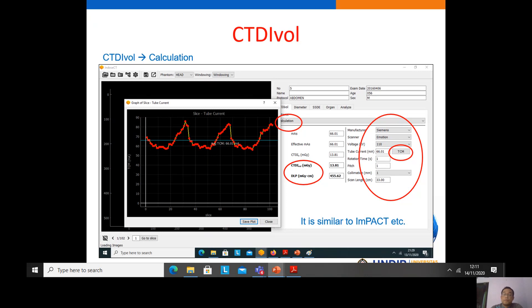If the images are obtained using the TCM (tube current modulation) technique, we can choose the TCM option to obtain the tube current for every slice of the patient images. We can also save this image of the tube current modulation.